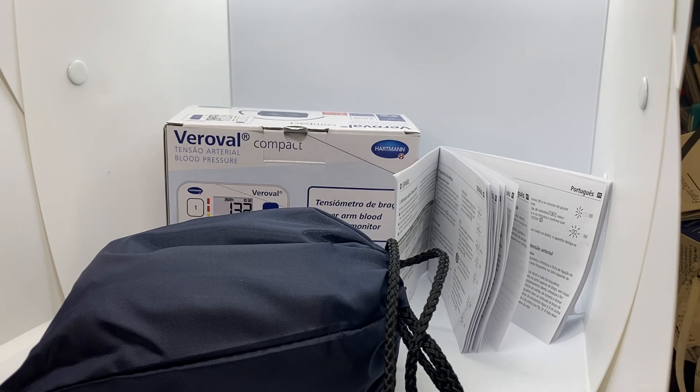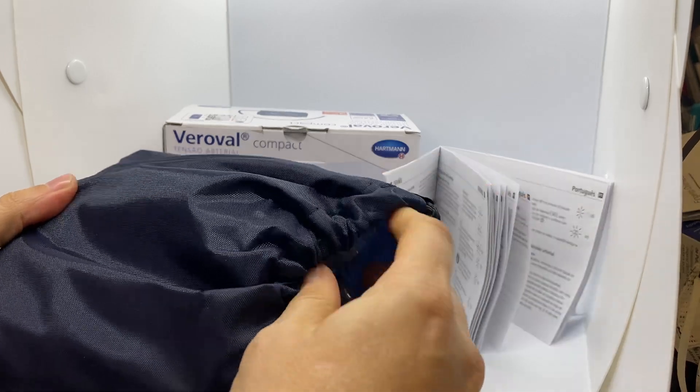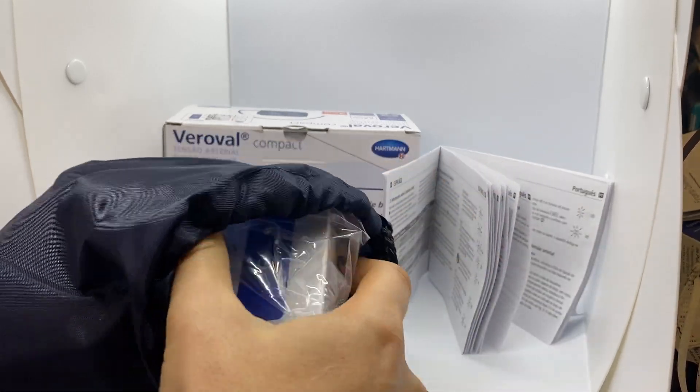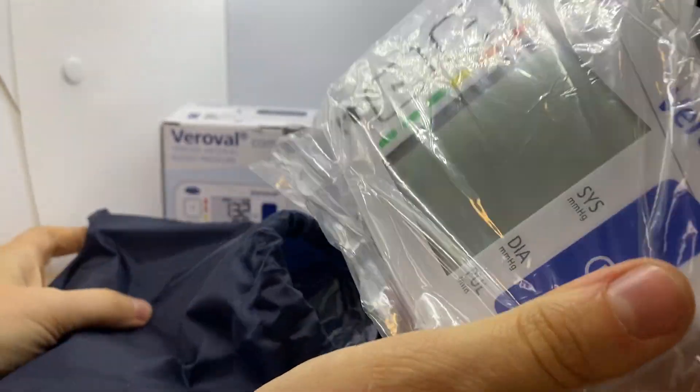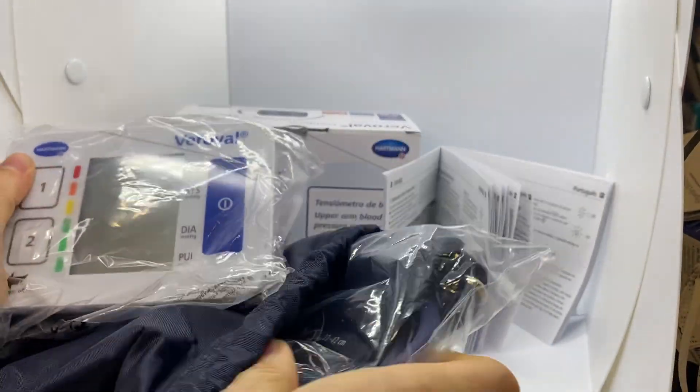Hi! Today we are going to show you how it works, this device to measure arterial pressure, the Veroval Compact Tensiometer. It is very compact, as the name indicates.